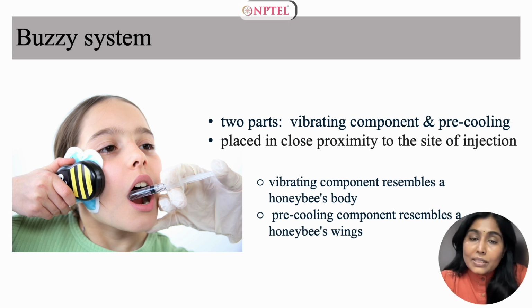The device is placed in close proximity to the site of local anesthetic injection and then kept activated throughout the injection period. So current research in dentistry is focused on the usage of cold temperatures in addition to the vibration device. The rationale for use of this technique is that as a psychological component, pain is reliant on the perception as well as the attention of the patient.